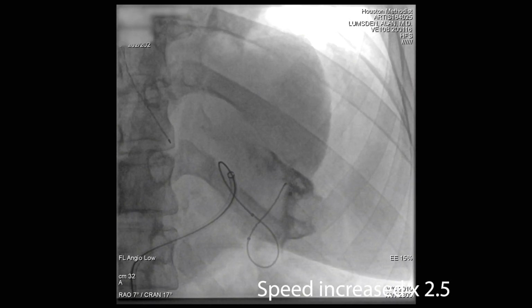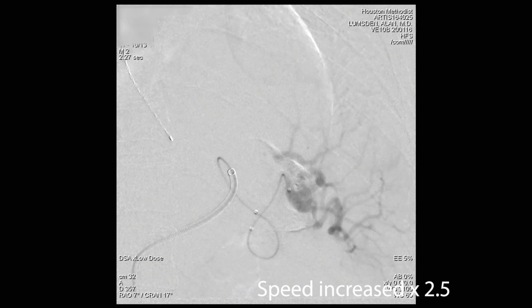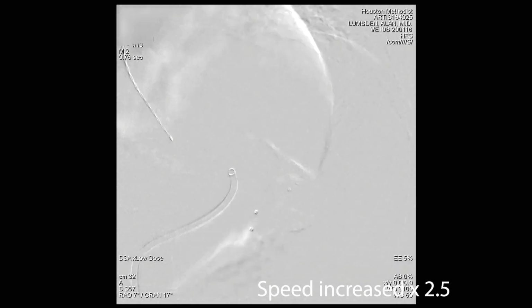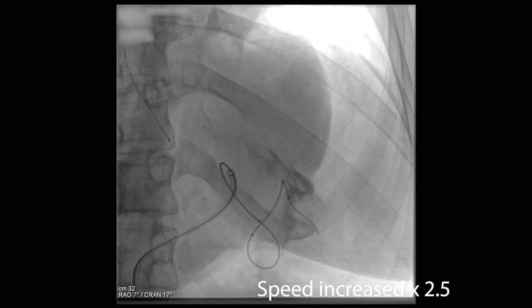and is that going to be associated with challenges in tracking devices out there. Coils almost always track, but not necessarily a Viabahn stent graft. So plan A didn't work, even though it's really one of the more proximal bends we had to navigate. It still wouldn't go out there far enough.